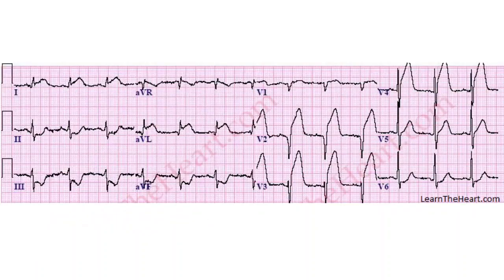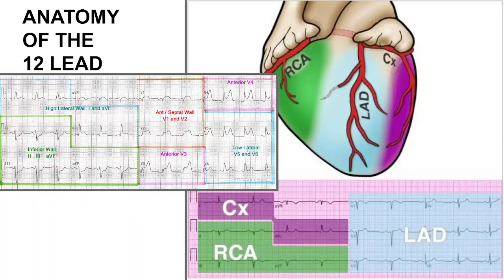Let's go straight to the criteria. Looking at leads V2, V3, and V4, you can see here there's a massive amount of ST segment elevation. This is going to be a patient who is probably not very stable. Moving over to leads 1 and AVL, some of you may have already noticed the ST segment elevation there, and of course reciprocal depression in 2, 3, and AVF.